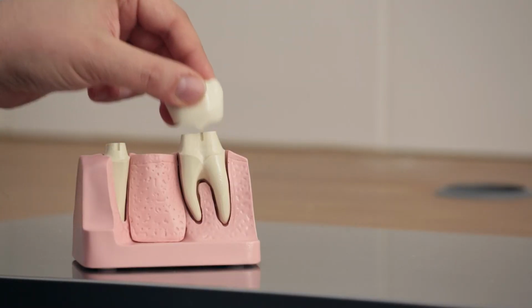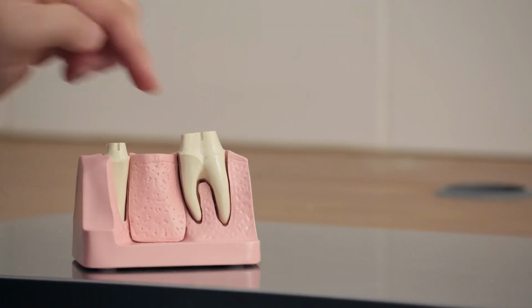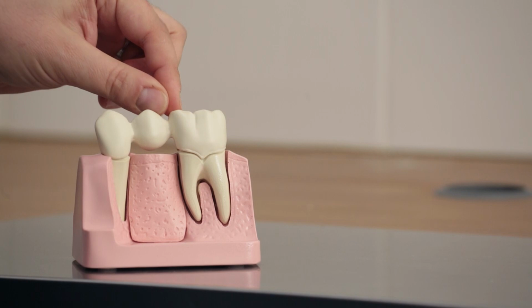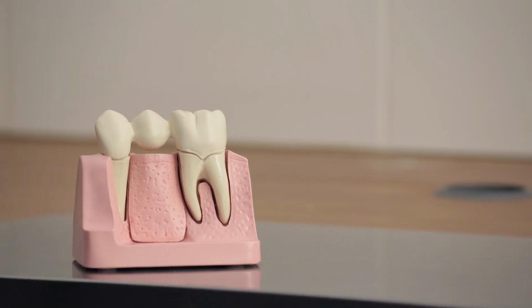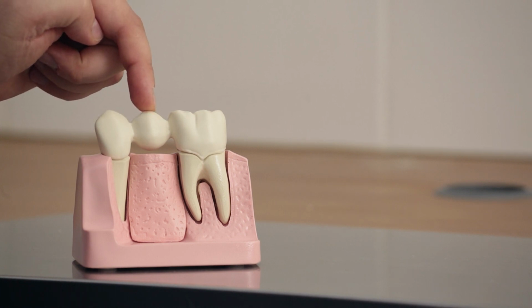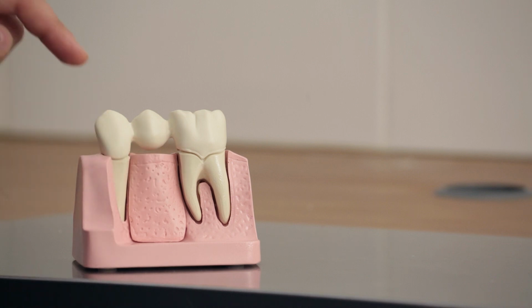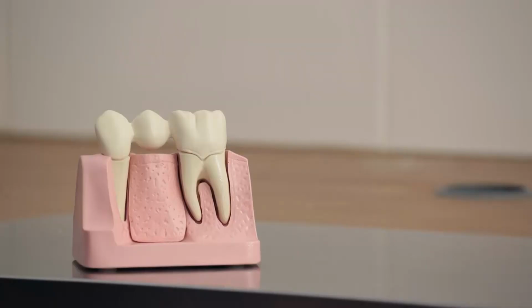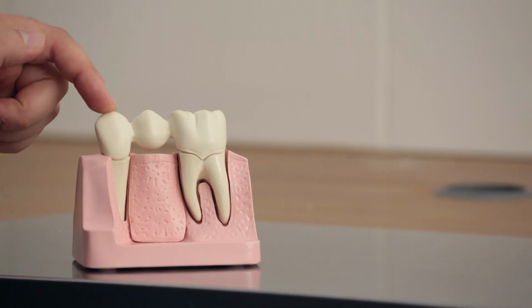So if I take these little crowns off, this is essentially the preparation that's required when you're having a bridge made between two teeth. In a dental laboratory, a dental technician will then make a bridge that will span from this tooth to this tooth. Essentially, this tooth in the middle is not supported by anything apart from the fact that it's resting on this tooth and this tooth. The tooth behind is now doing a little bit more work, taking more stress, and it's shared again with the tooth at the front.